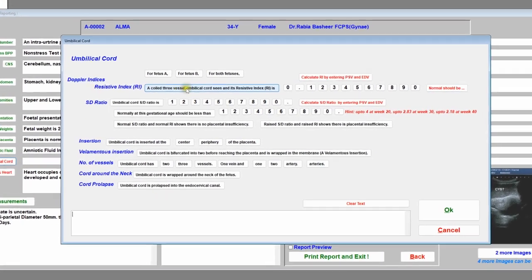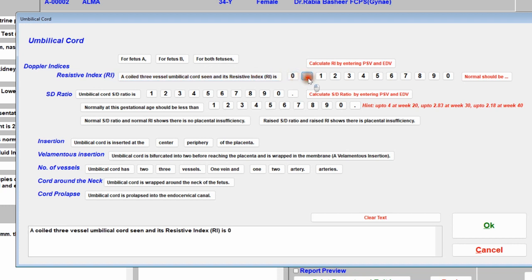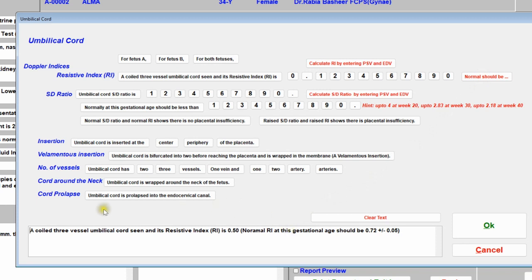For umbilical cord: a three-vessel umbilical cord is seen and its resistive index is 0.50. Click 'Normal' and the software will calculate what the normal RI should be at the fetal age you entered in the measurements. This is why it's essential to enter measurements first — at least BPD, abdominal circumference, and femur length — so the software can automatically calculate fetal weight and RI normal values.